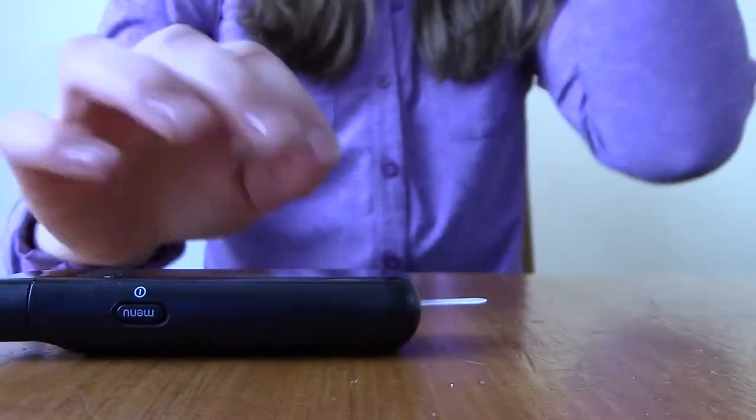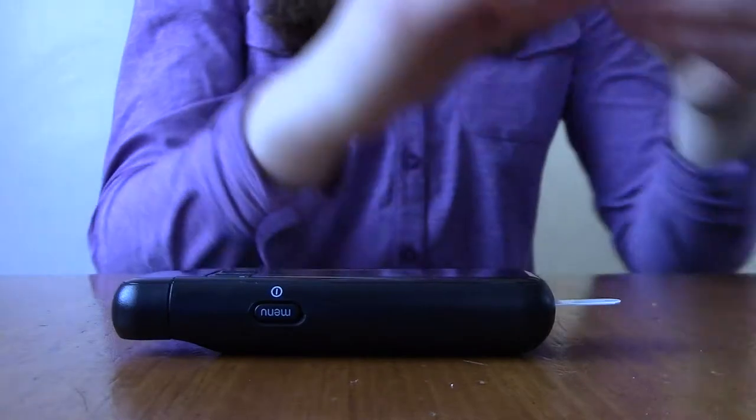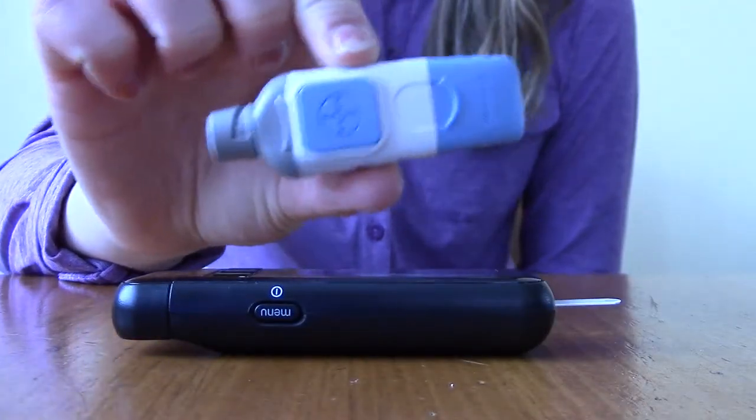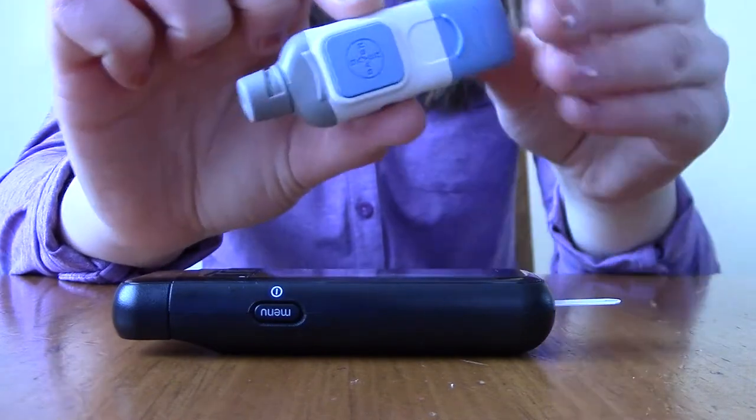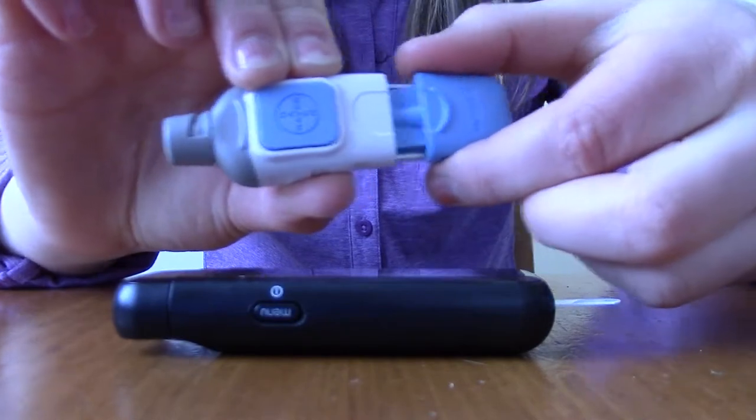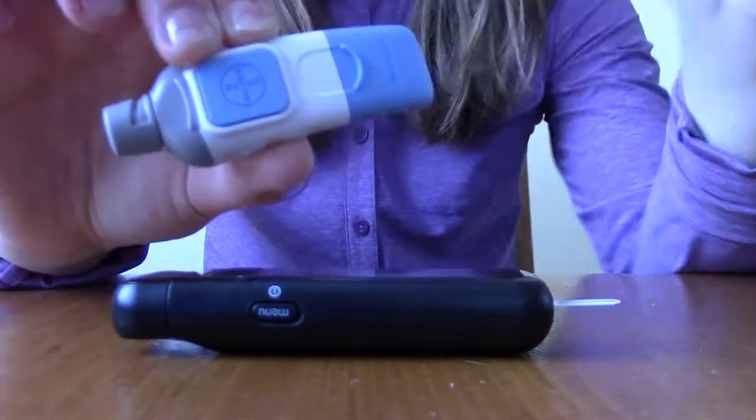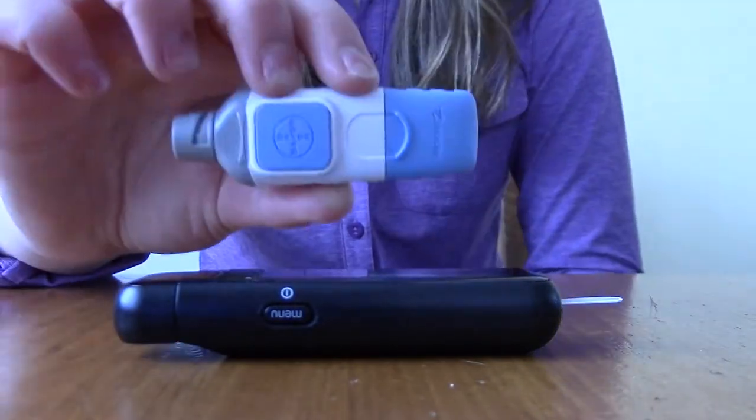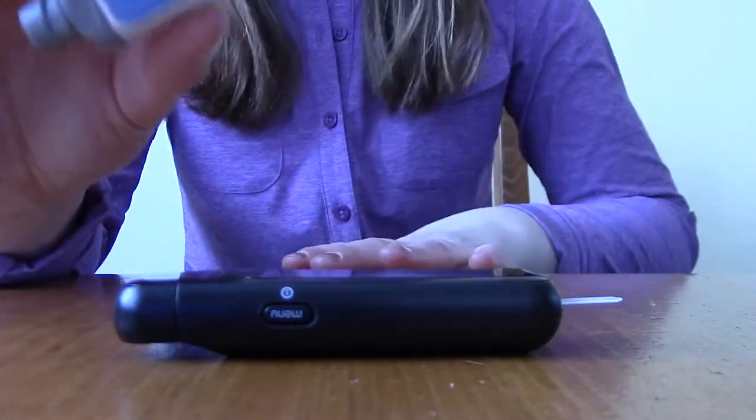Alright, so next I need to take my lancet. This right here is what's going to poke into my finger and make the blood come out. In order to prime it—or pump it back—for mine I just pull it back, but keep in mind that each lancet device is different depending on the company.